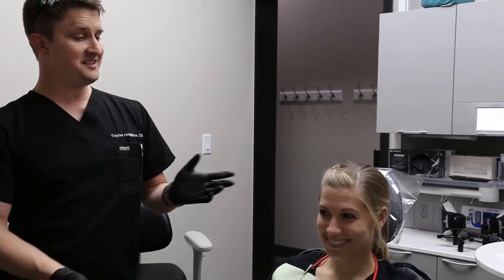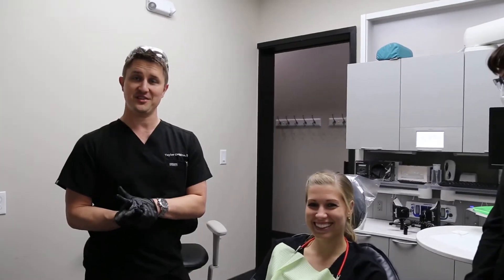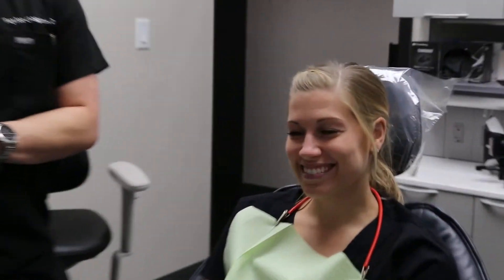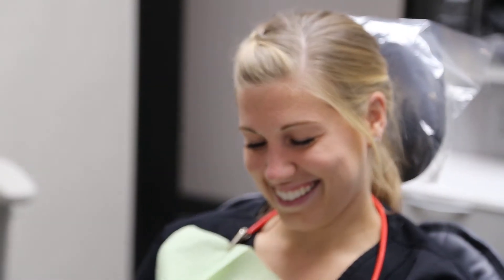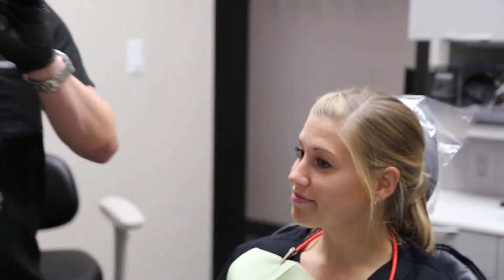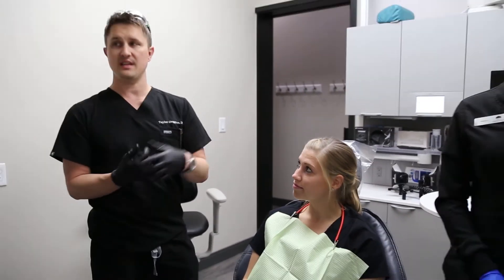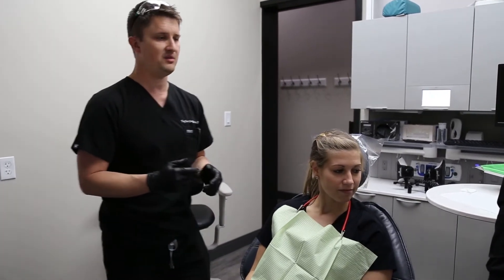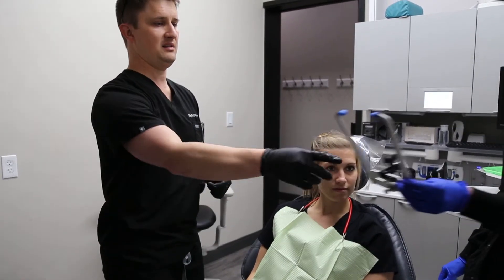Today we have our lovely assistant, who is actually our hygienist here at Denver Restorative Dentistry. This is Christy. She has volunteered very willingly to participate in this demonstration. We're going to go over a couple of the instruments and products we'll be using to take the face bow.